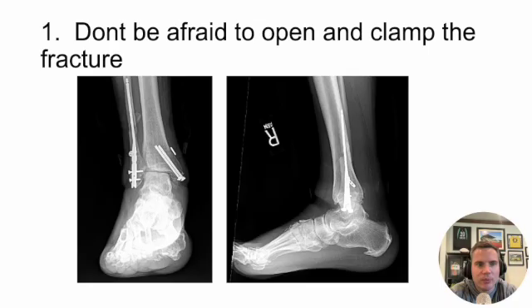Tip number one: we tend to think about doing these as percutaneous cases, but don't be scared to open and clamp the fracture. I'm showing a case here — not mine — where the fibula was never really reduced. You will open and clamp a tibia, you will open and clamp a femur — so it's certainly reasonable to open and clamp the fibula. There's nothing wrong with a couple-centimeter incision. You still have the advantage of not having any hardware directly underneath that incision.